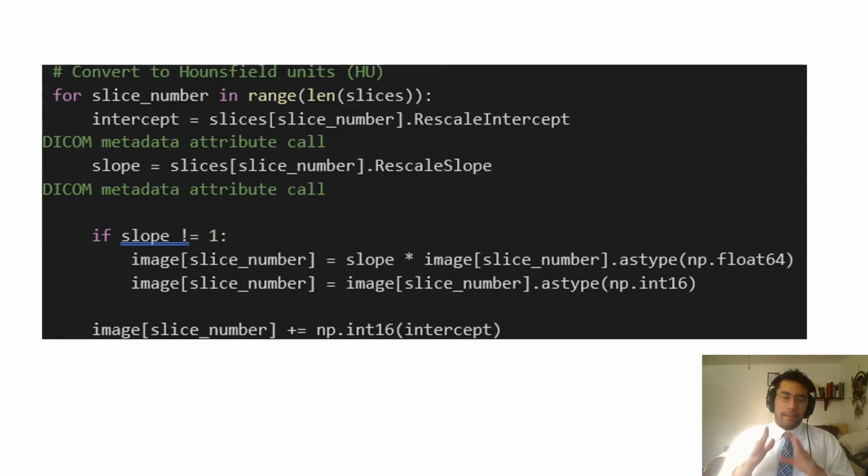Mathematically speaking, statistics and classification play a role in this, but we'll take these easy steps here. What we did is we set two variables, intercept and slope, and multiplied them against the raw pixel image as a float, and then we're generating a new value to be kept for analysis.